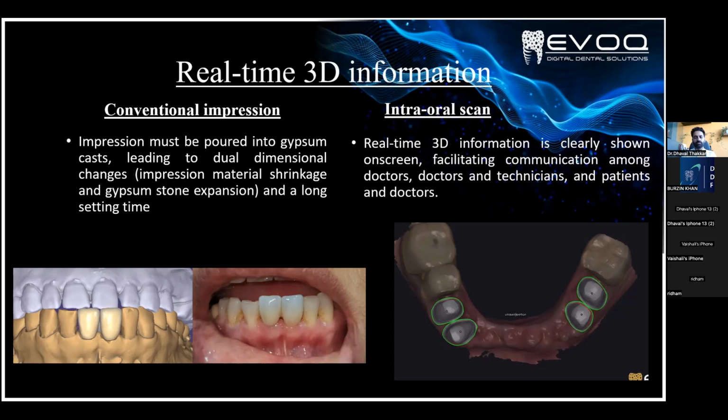So basically, it can be due to plaster shrinkage, expansion, rubber-based shrinkage, expansion, or alginate impression. If an alginate impression is taken, it might have dried and then been poured later on. So these are the problems which we can overcome.